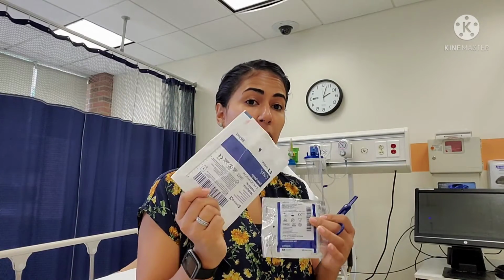If my chest tube comes out, I'm going to go ahead and put the appropriate dressing. Like I said, it might be just a regular 4x4 gauze, or it might be a petroleum dressing. Whatever I'm going to do, I'm going to put it on and tape 3 sides, and one side is going to remain open. Remember that we can cause a pneumothorax if we completely seal it. So 3 sides, okay? And then obviously it's an emergency, we're going to call the provider.